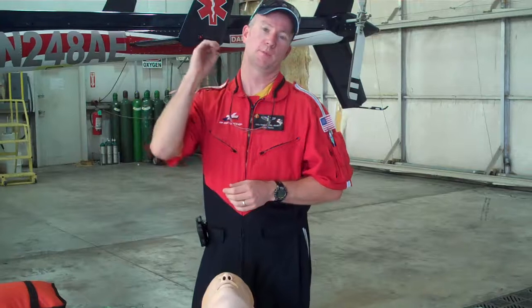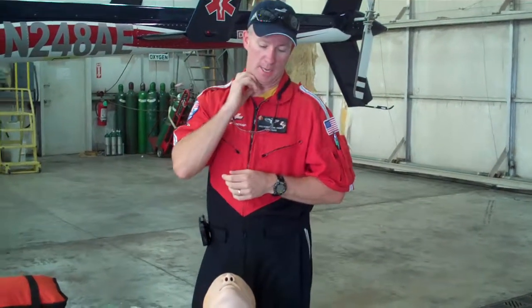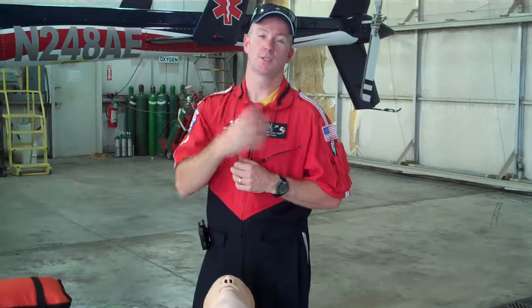You want to be very careful not to penetrate any arteries, especially along the thyroid glands. So it's something that you need to take time with, and you need to keep a steady hand so that you're not going to cut any vessels. That's going to also impede your view of placing the tube and cause harm to the patient.